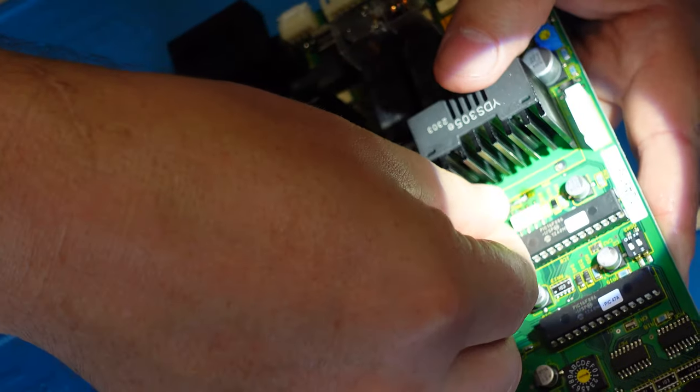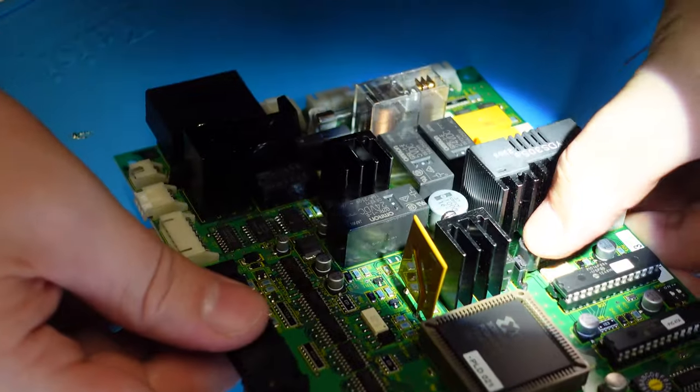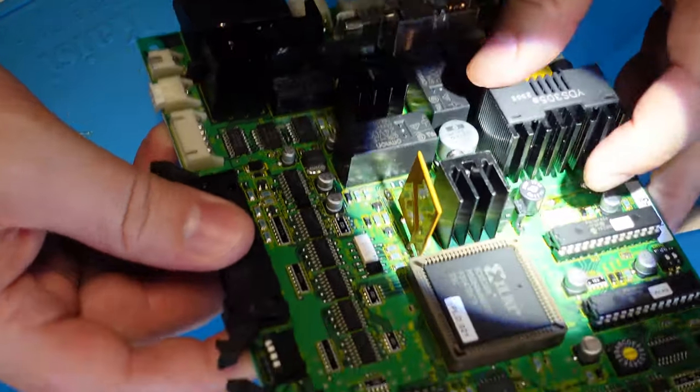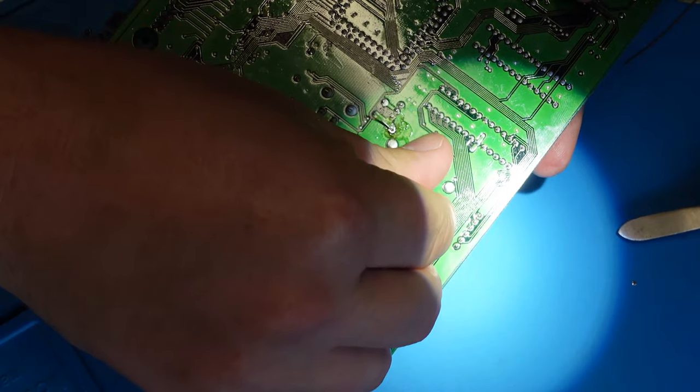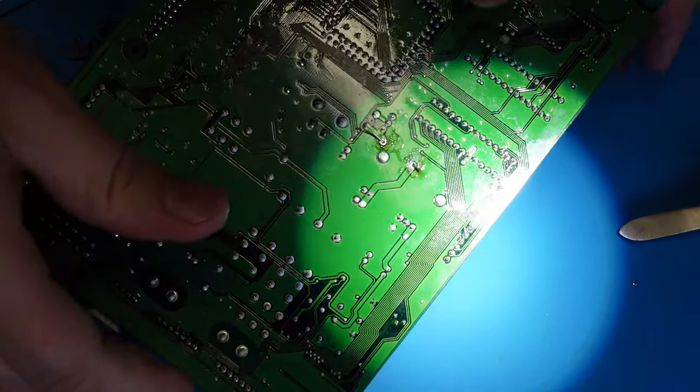There we go. So the fuse is going to sit down flush to the board, just like that. And from the back side, I'm going to bend the legs out just a little bit to hold it exactly in the position I want.